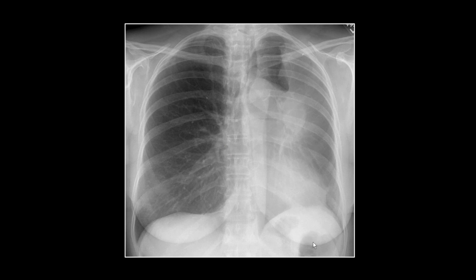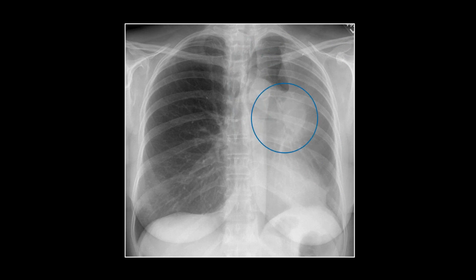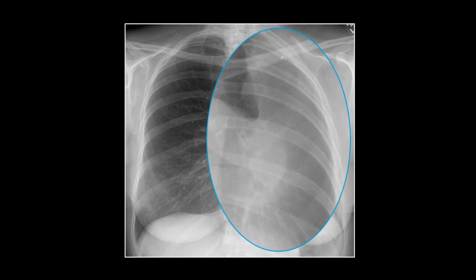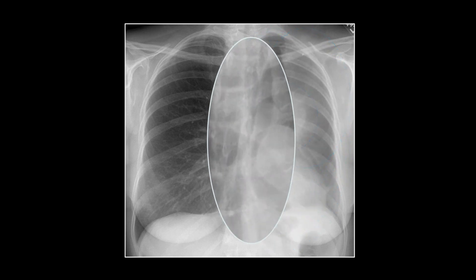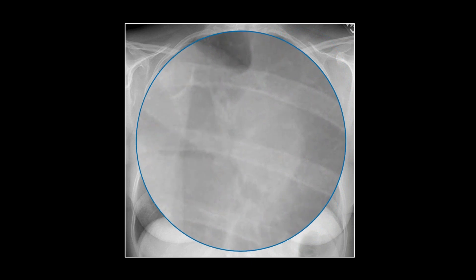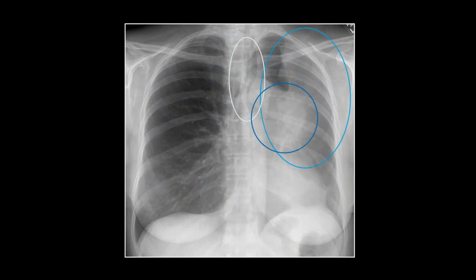Our first one is a classic left upper lobe atelectasis. You can see the atelectatic left upper lobe — it will drop out laterally and anteriorly as it loses volume. There's also a big mass in the hilar region and significant volume loss on the left. The trachea is shifting, and there is a mass with actual tapering of the left mainstem bronchus visible.